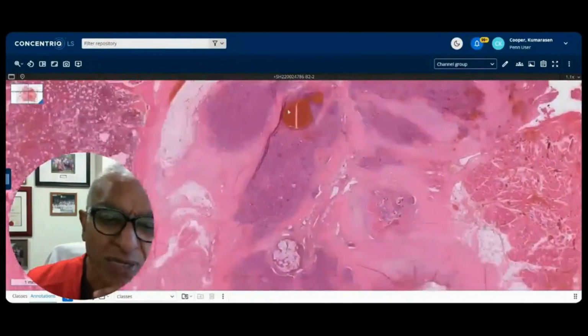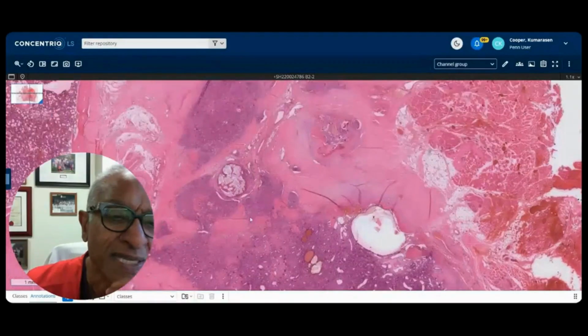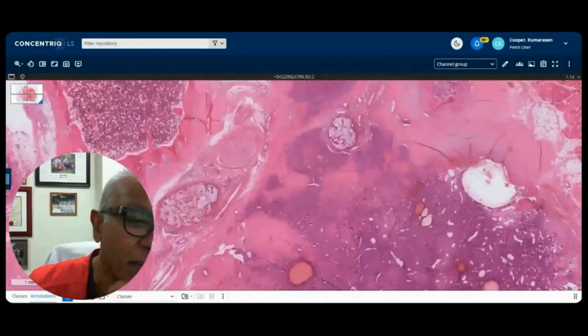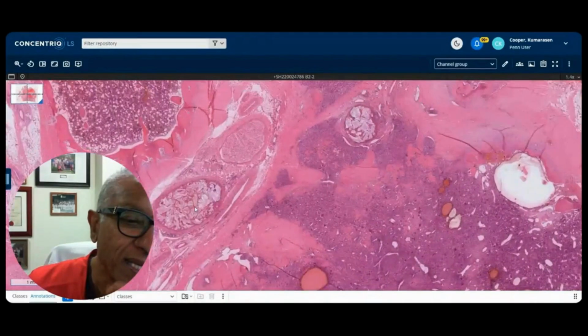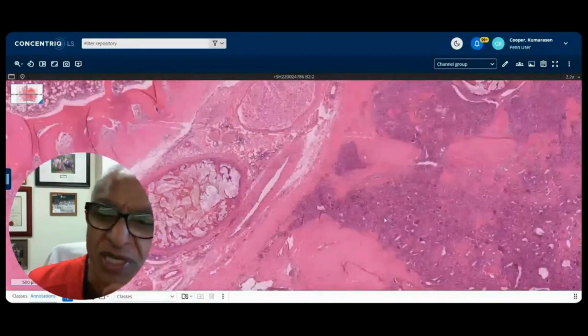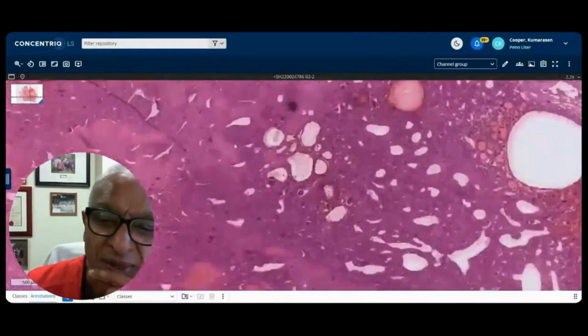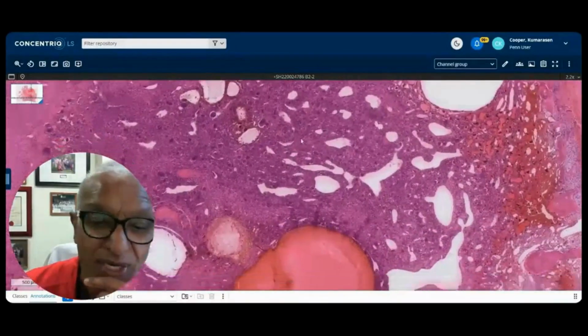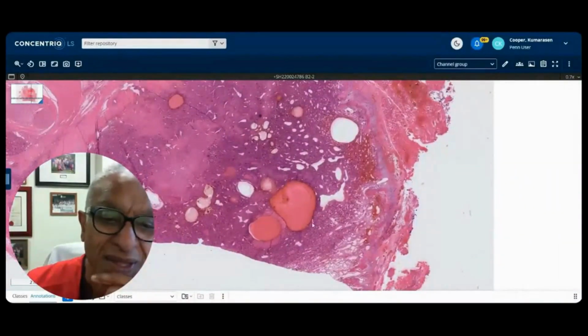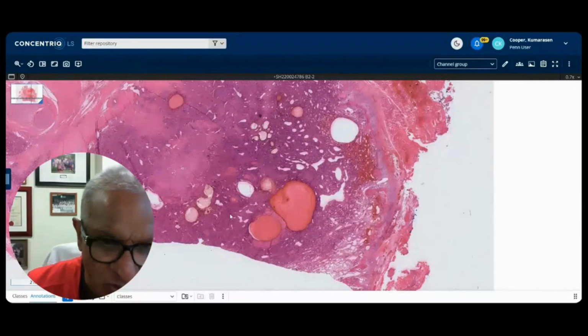I was showing you many of these materials that have been the embolic material that they use, just to not confuse with aneurysmal bone cyst changes. And Jan, you're quite correct. There's some here which have these so-called almost microcystic rather than macrocystic changes. So you don't see it grossly, and you don't see it on the radiology.